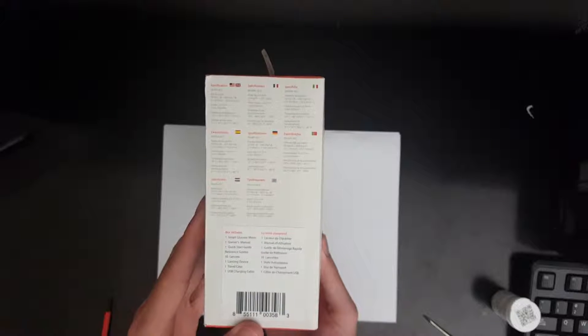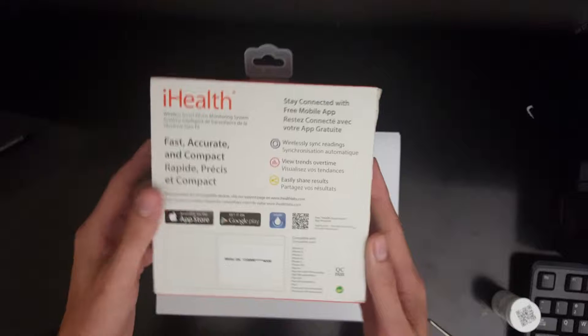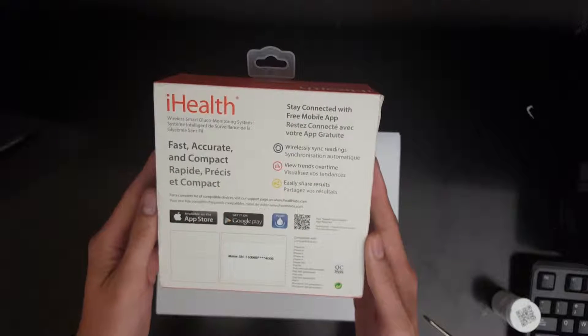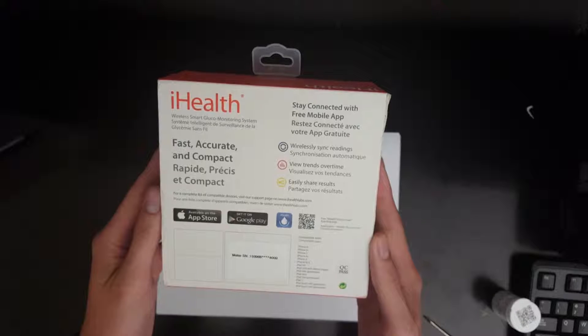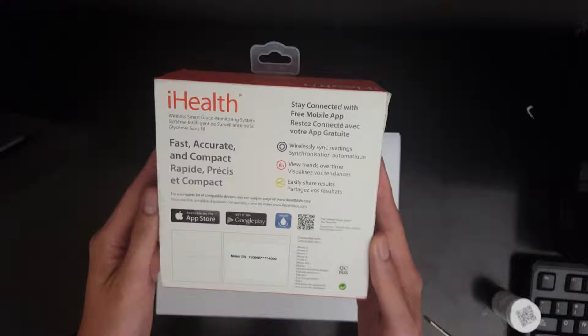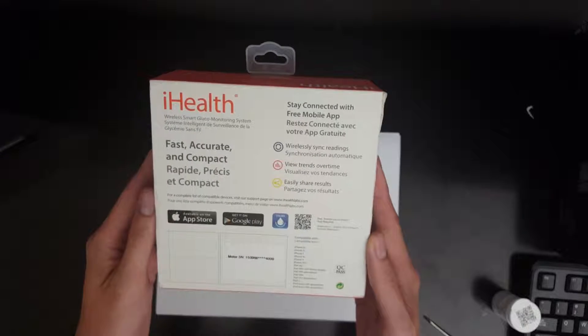When we turn the device around, we can see there are multiple languages presented. On the back, we see that there is an app available on the Google Play and the Apple App Store that users can download, and also a QR code that users can scan to gain more information about the device.